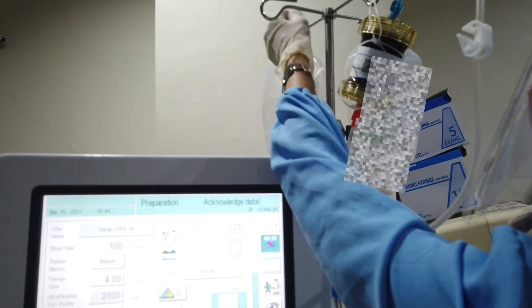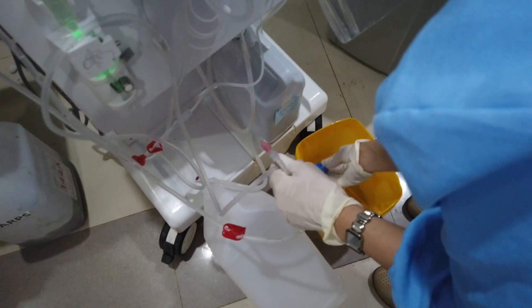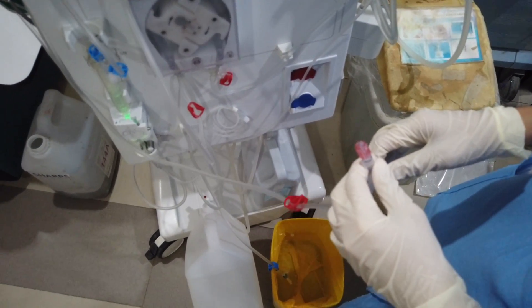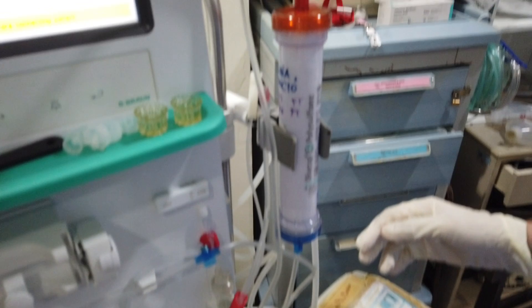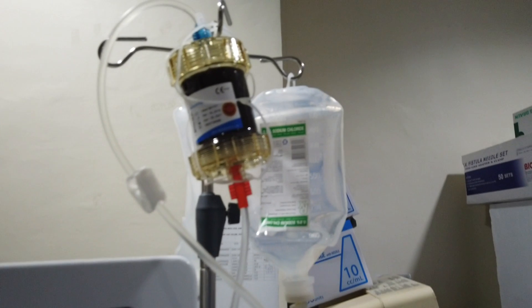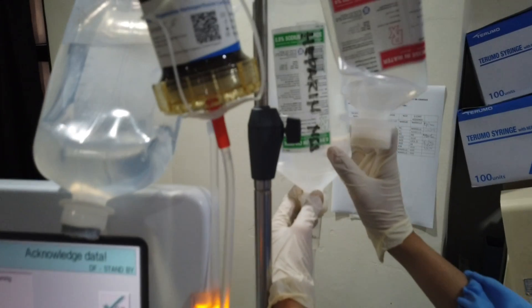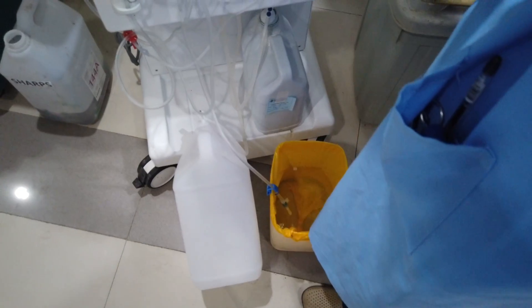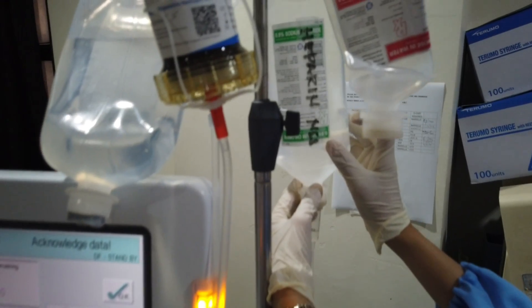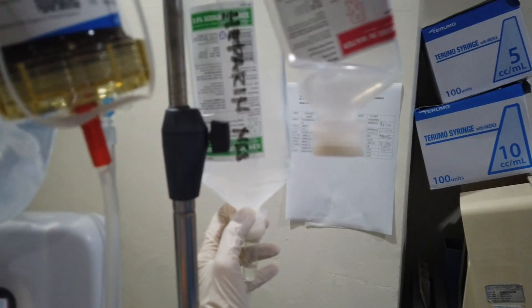Then connect it to the dialyzer, red to red. Since the setup is in recirculation mode, detach the arterial and venous patient's end. Hook the blue end to the bin and make sure the clamp is open. Attach the arterial end somewhere and the clamp should be closed. Start the blood pump and now you're rinsing it with 1 liter PNSS. Once consumed, stop the blood pump and change the 1 liter PNSS to 1 liter heparinized PNSS.